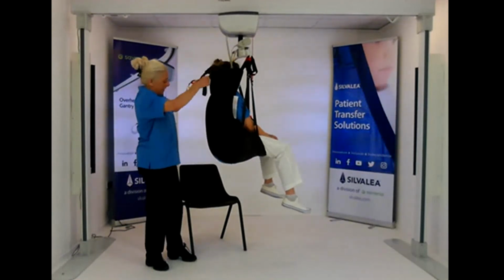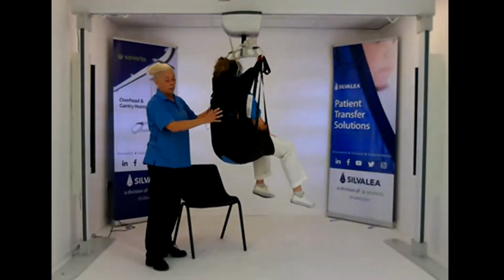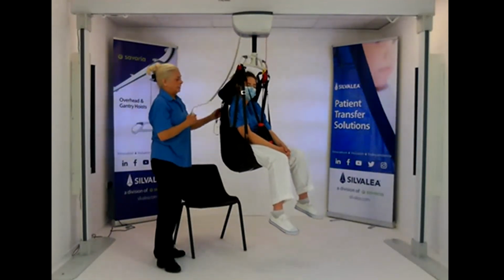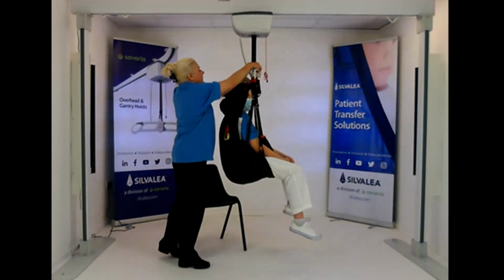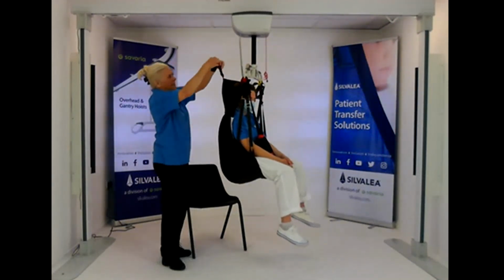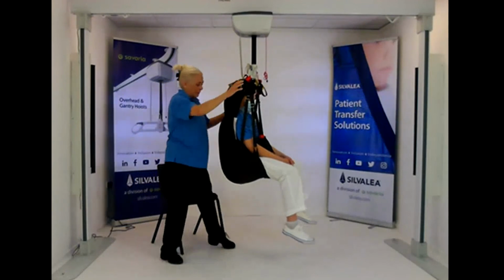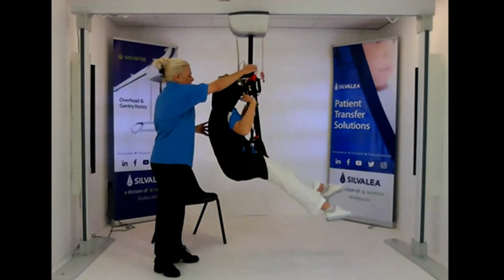The head support tape you can add, but there's a neck roll in there. It's actually ridden up to her neck now as she's stretched within the fabric. But if we just down a little bit, I just hook up the head support, and there's several different settings here, but if we put it on the short one, and ask Laura if she can extend. So if she extends or twists.